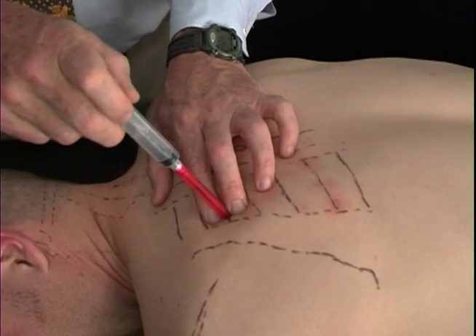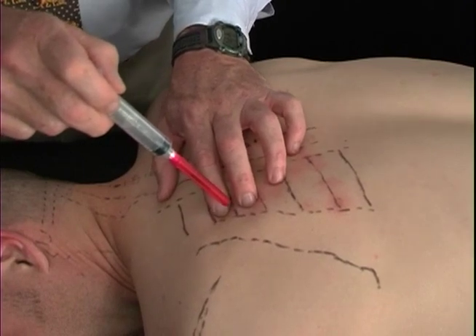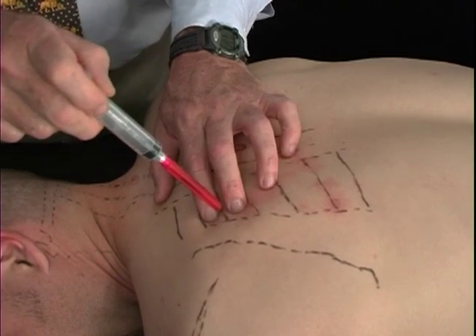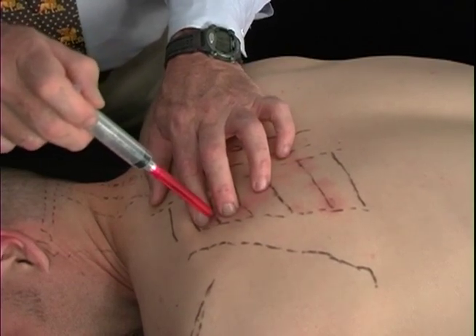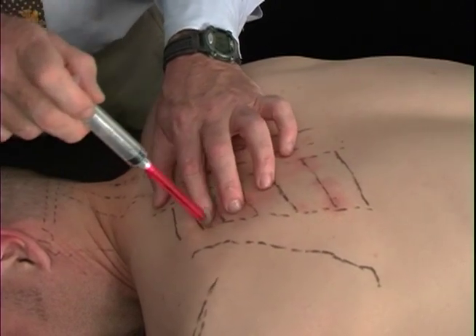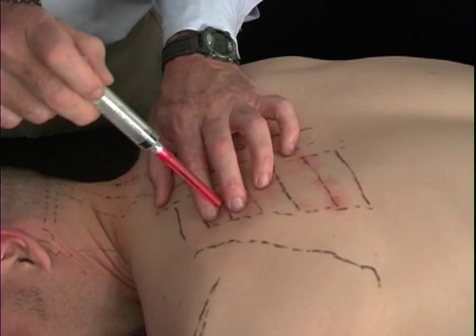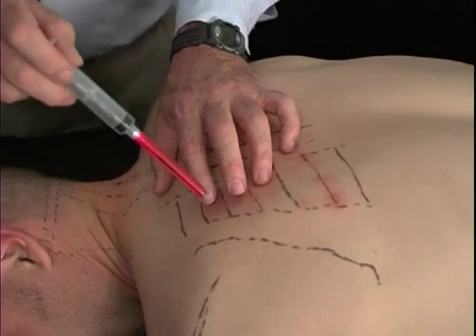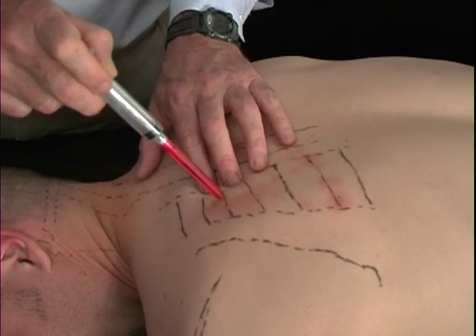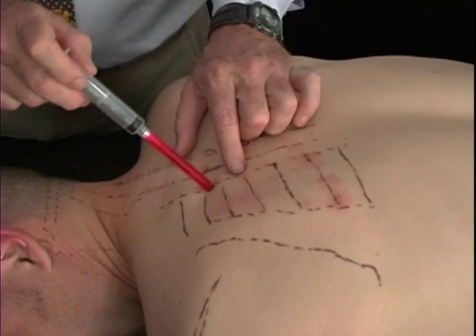If I don't hit it at that same depth that I hit it here, then I'll come back out to the skin level and I'll move down a millimeter or two and go back into that level. If I don't hit it there, I'll come back up. There's my midline, come up a millimeter or two from midline and try it again. That way you're experimenting at that same safe depth where you know you've hit this rib and moving the syringe up and down. And ultimately then you'll find that rib and then you can follow your line across again to the midline of the costotransverse process.